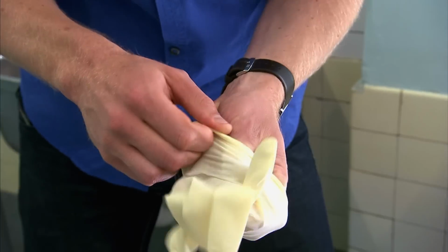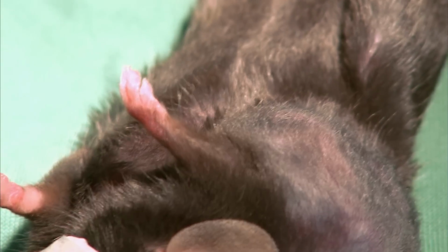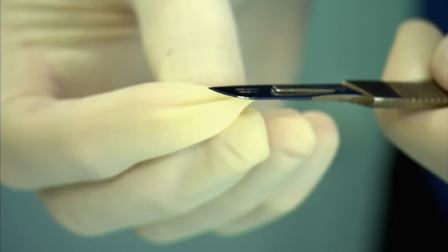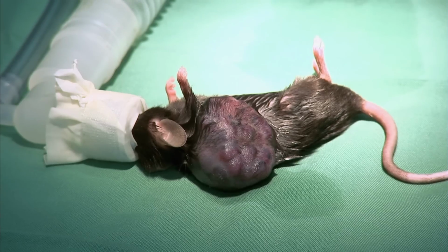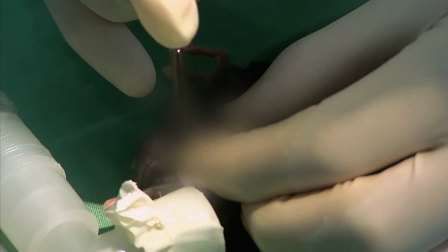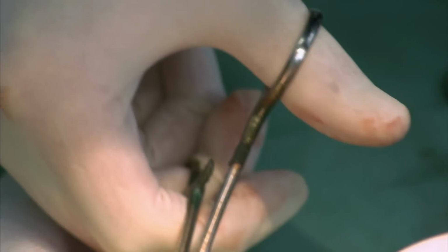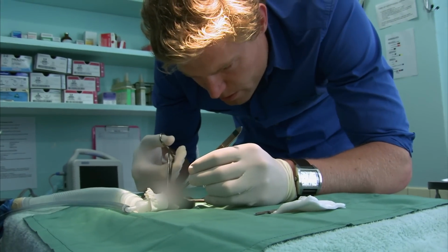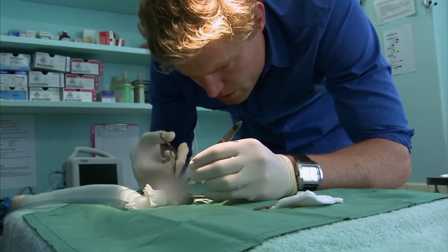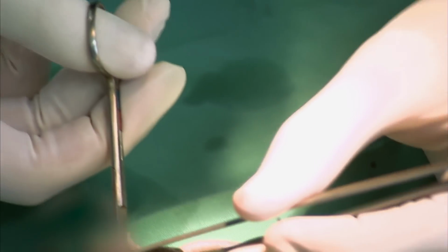It all gets very serious all of a sudden once the clock's ticking like this. She can really only be under anaesthetic for 5-7 minutes. And that's about it. The idea is hopefully just to get in and around it and shell it out like a pea. Just working my way through these blood vessels that are feeding this immense tumour one by one, just trying to crush them as we tear them in the hope they won't bleed anymore.